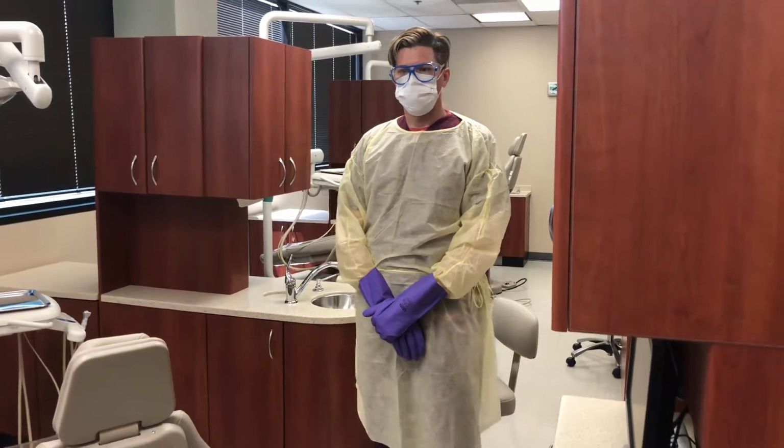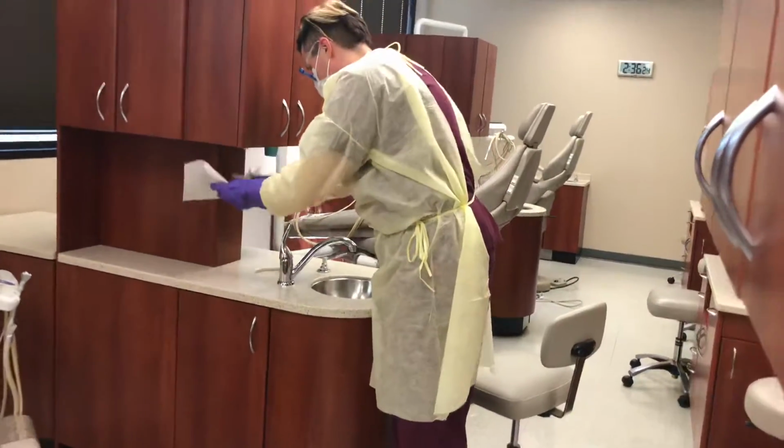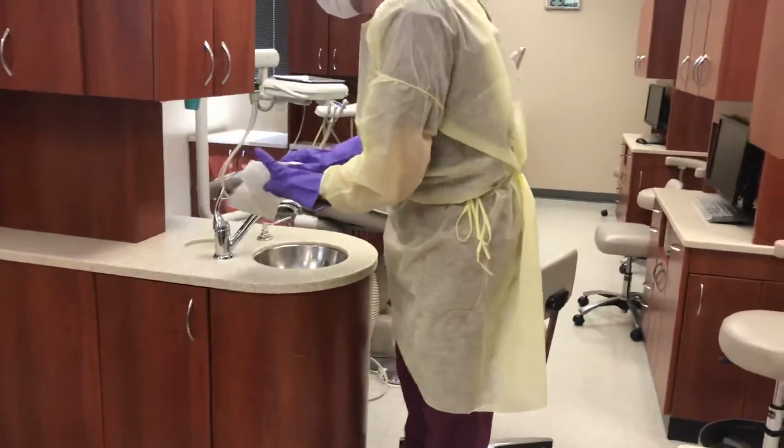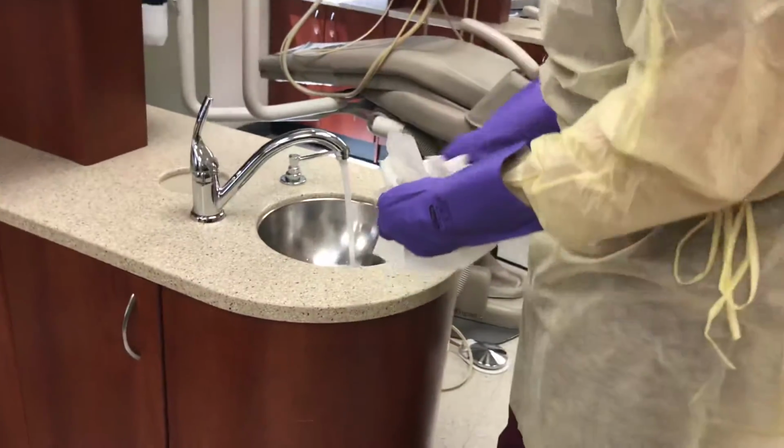Using paper towels dampened with water, clean the following surfaces. Place paper towels under running water and sink to dampen. Be sure paper towels are wet enough but not dripping with water.